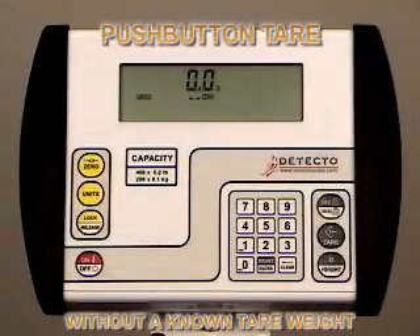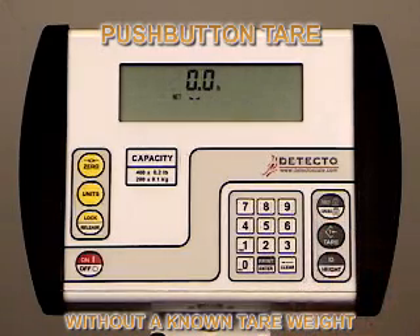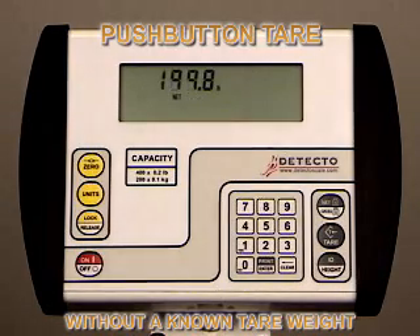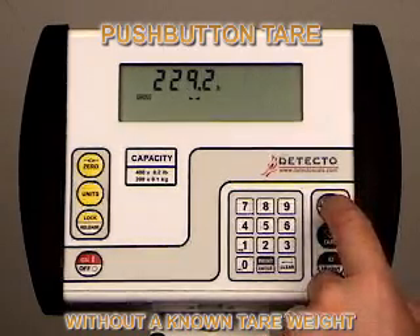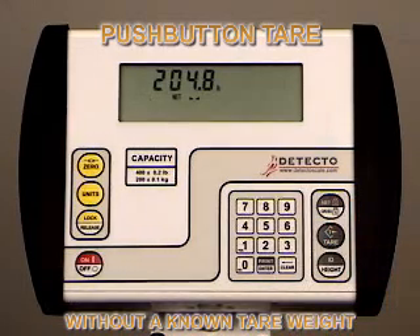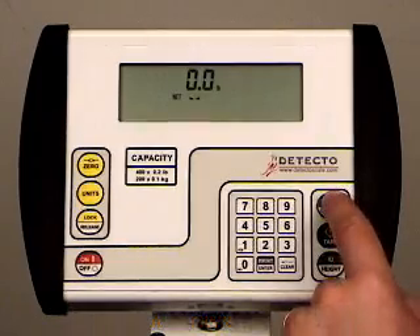Push-button tare operation without a known tare weight is a simple two-button process. The object being tared is placed on the scale, whether it's a walker, wheelchair, or whatever is being tared. Press the tare key twice. The indicator will display zero net. Then remove the wheelchair or walker and return to the scale with the patient to be weighed. The patient and the tare weight can now be weighed on the scale, and the net weight is displayed on the indicator — this is the weight of the patient only. You can press the gross key to show the gross weight also, and press it again to toggle back and forth between gross weight and net weight. When the patient and the object are removed from the scale, the display returns to zero. Press the gross key again and it will show the tare weight.